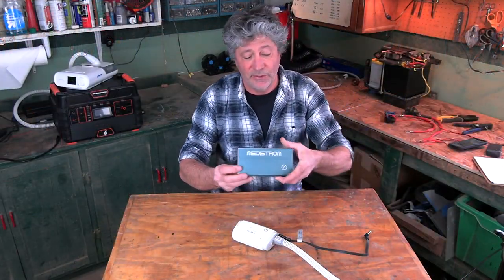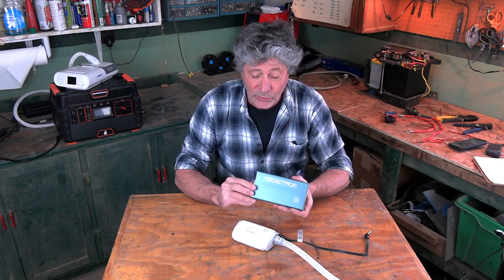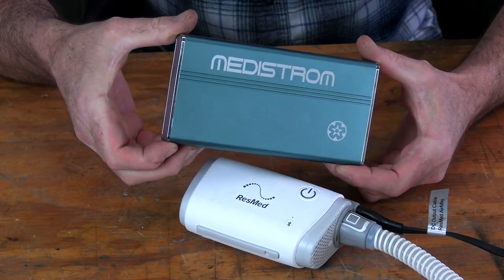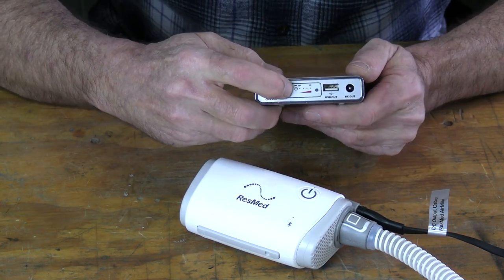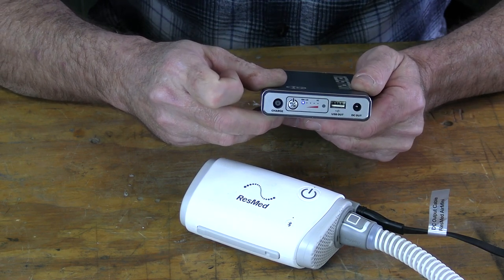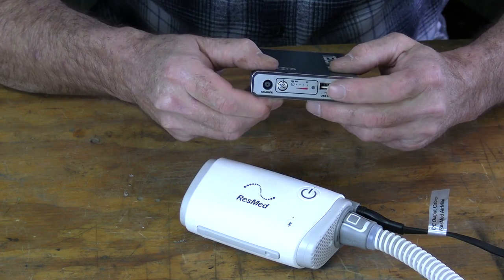This little battery unit is all that's needed to power it, and I was able to get two full nights of sleep out of it. It is the Medistrom Pilot 24 Light. On the end there's a power button, a little blue light to show you that it's on, and four power indicator lights.